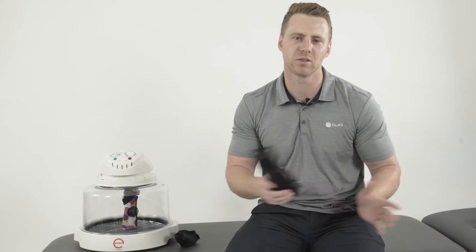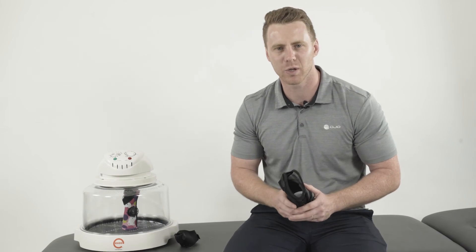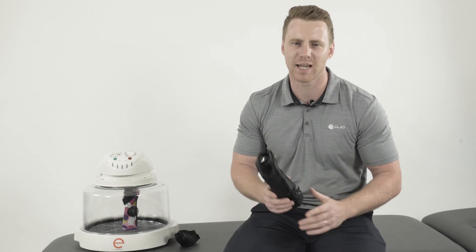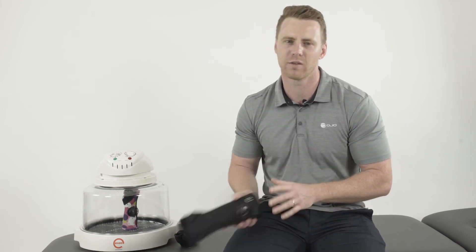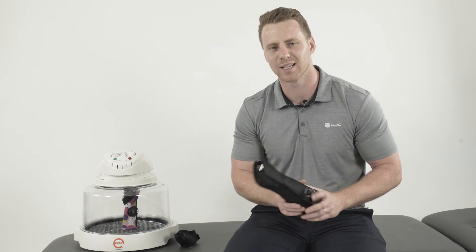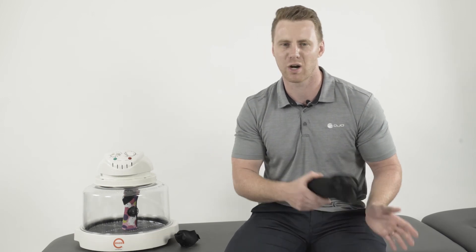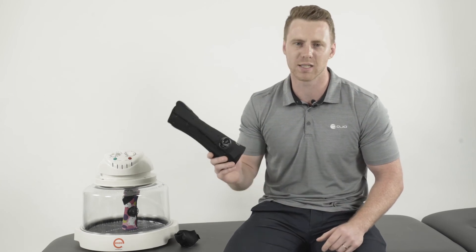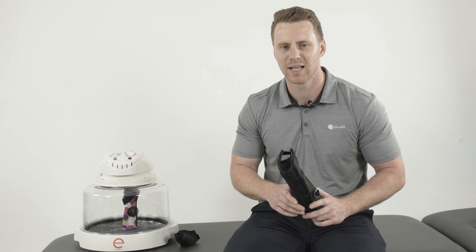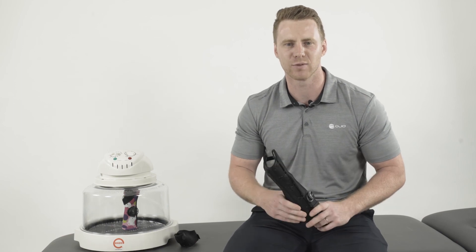Exos has already been widely implemented by a range of clinicians — physios and hand therapists in rehab settings, fracture nurses in fracture clinics in acute settings, and surgeons prescribing these post-operatively. If you think your patients would benefit from an Exos cast, get in touch with us and we can come and provide training for your team.